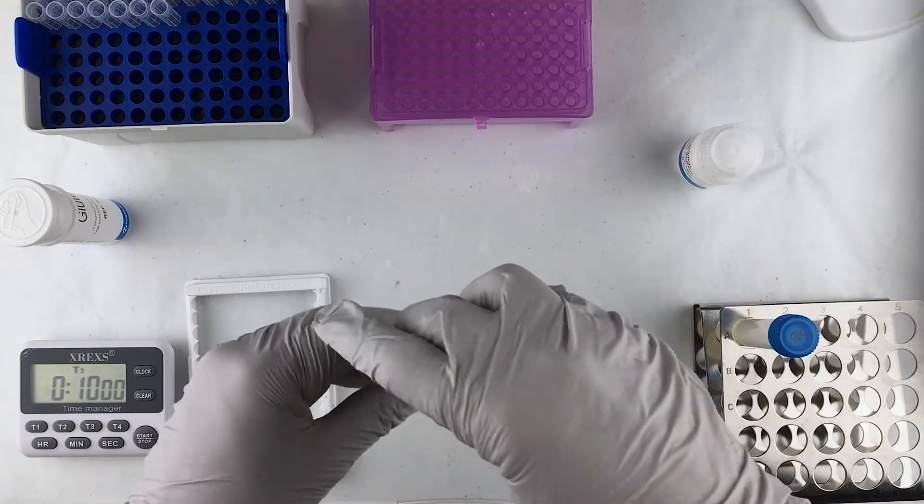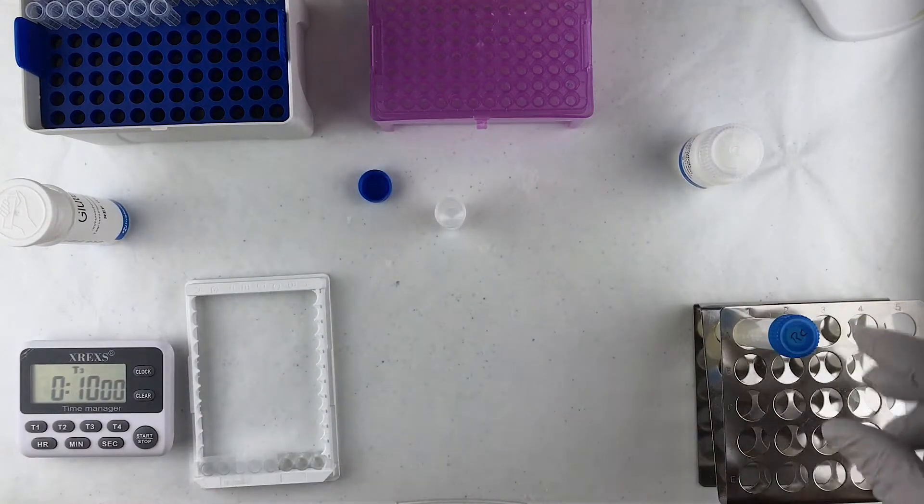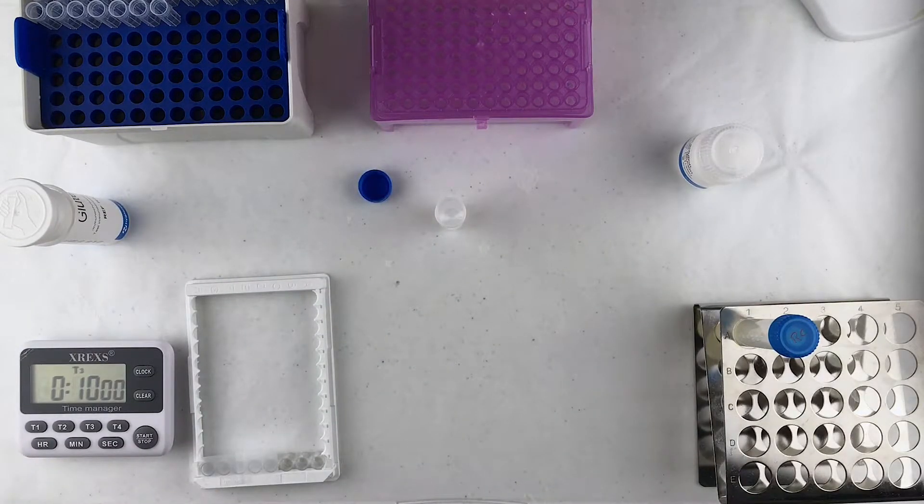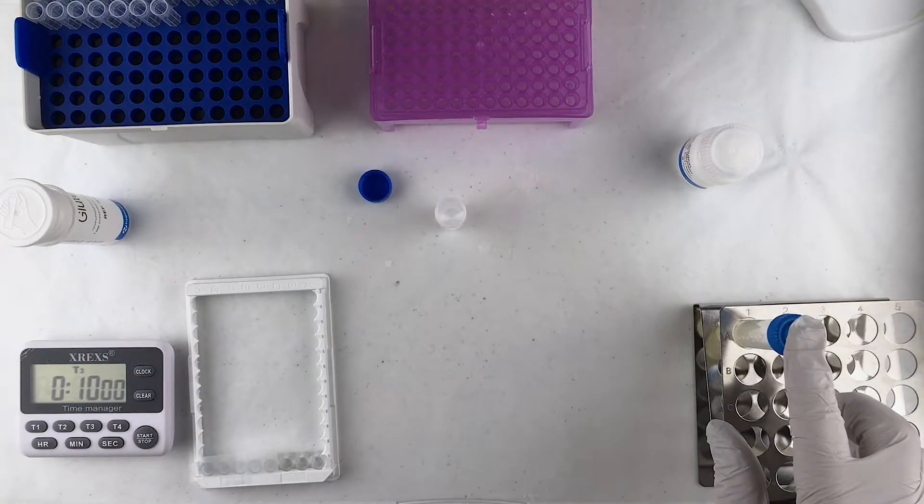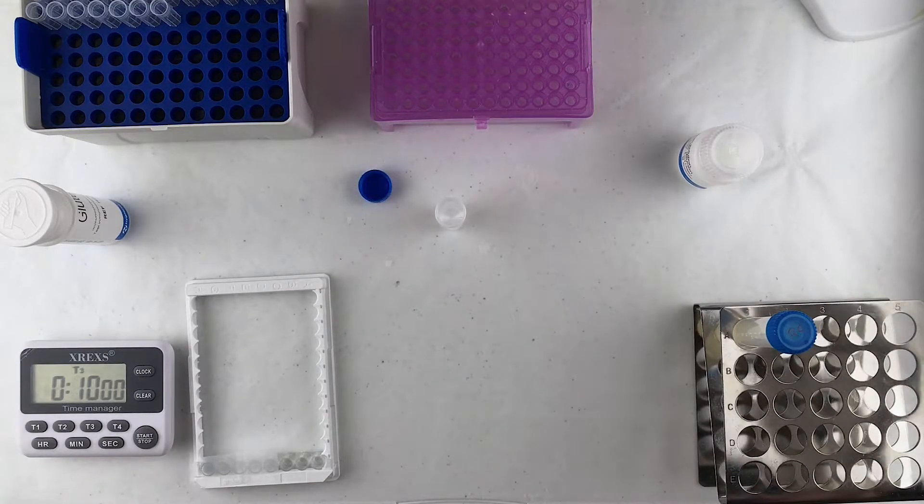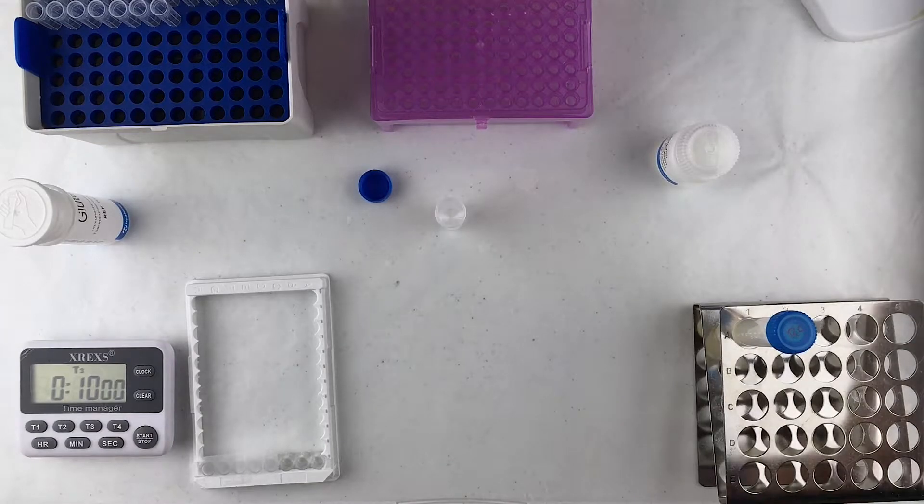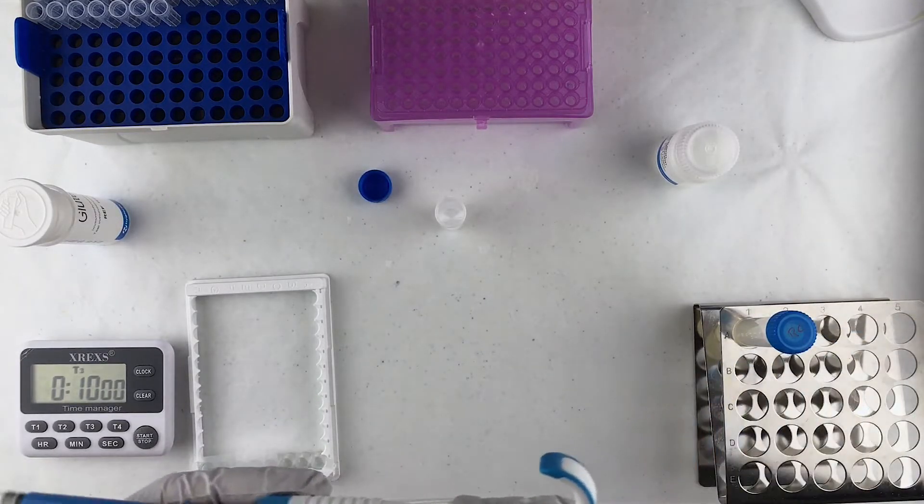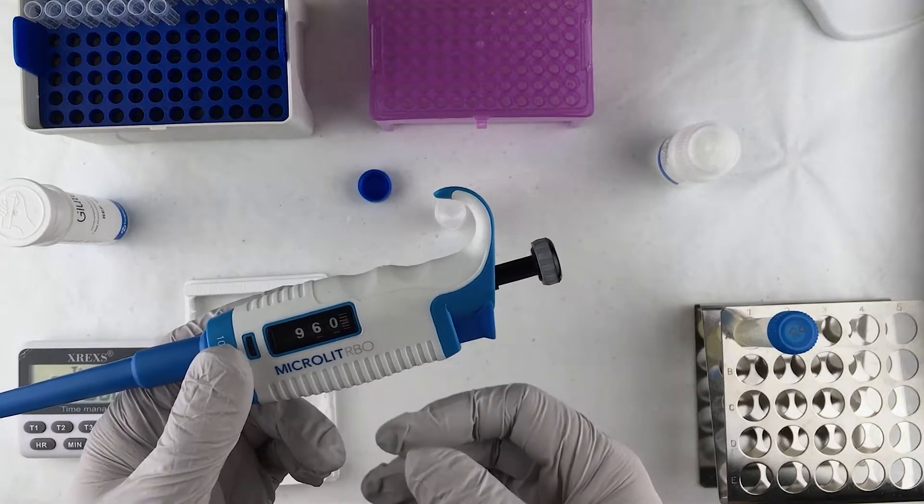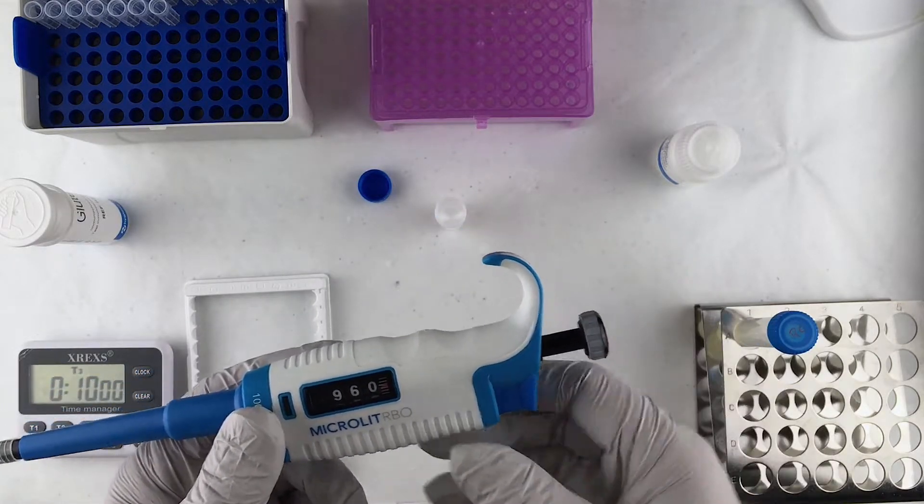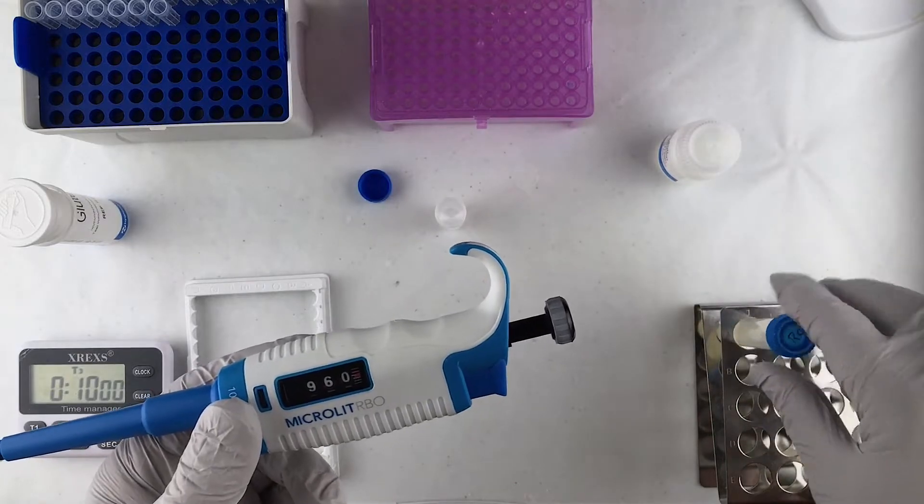And we do that in this empty vial. So we're going to do this at a limit of detection of three parts per million. What that means is a one to 25 ratio of extracted food sample to dilution solution. So at one to 25, what that means in practical numbers is 960 microliters of dilution solution and 40 microliters of the food sample.